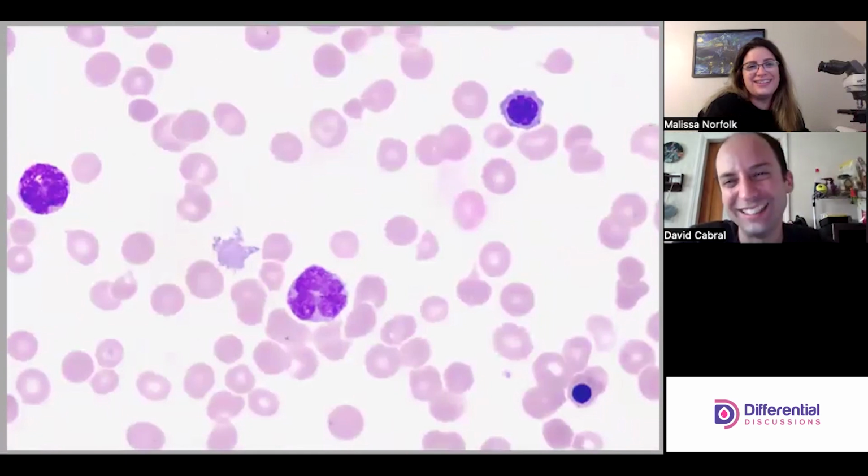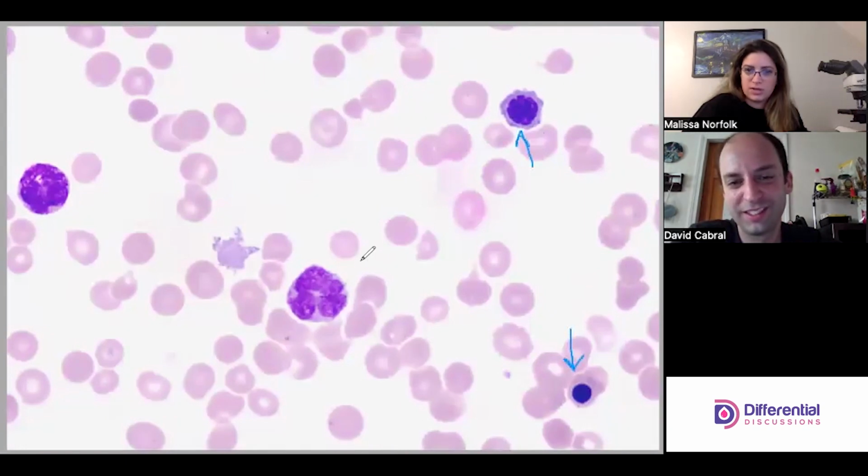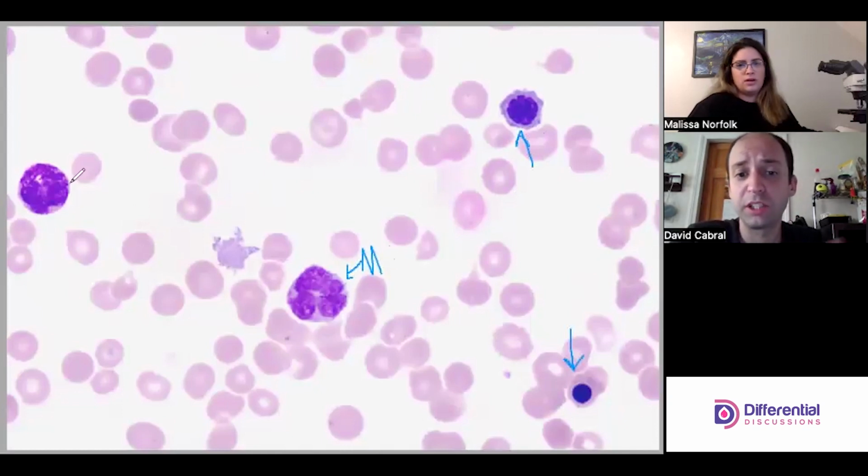How convenient. Yeah, that's okay. This one is a challenging one though. So we have NRBCs. Agreed. And then this one actually looks like a mono. Yep, I agree. We have a monocyte here. And so there's a little bit of a pink coloration to the monocytoplasm. They can have pink granules, totally normal. And then far left, I love this.